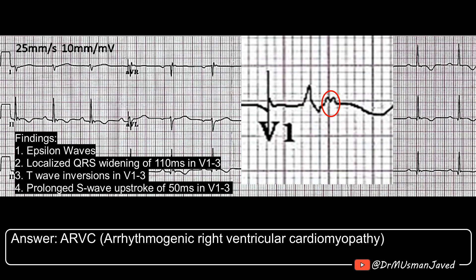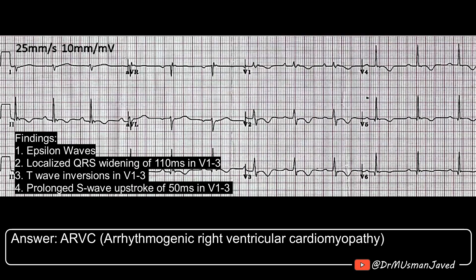This is a magnified view to show the epsilon wave. There is localized QRS widening from V1 to V3, along with T wave inversions. The S wave upstroke is delayed, with a long S wave upstroke of more than 50 ms in these leads.